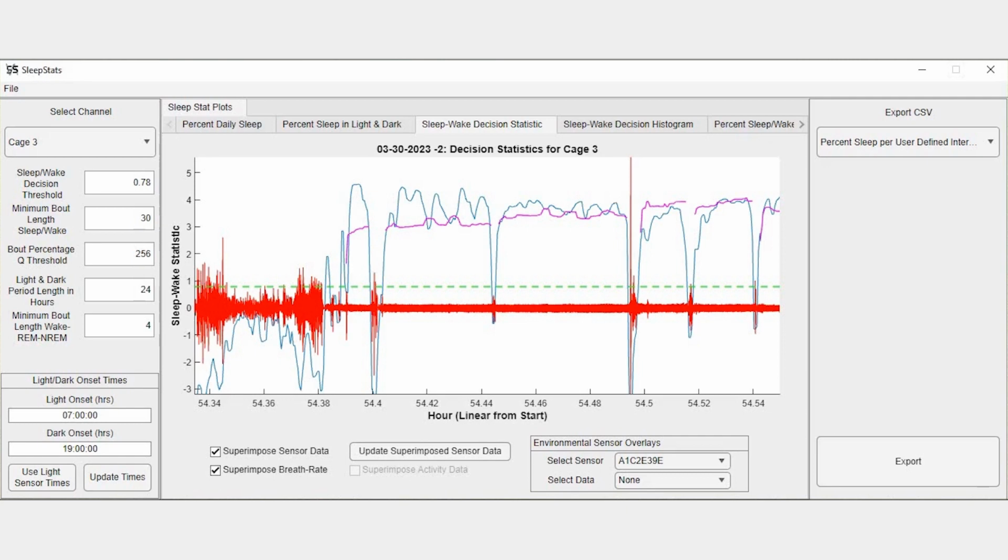Breath estimation accuracy requires a good signal-to-noise power ratio. So, if this feature is used, it is important that the respiration signal is consistently stronger than noise signals from the room.